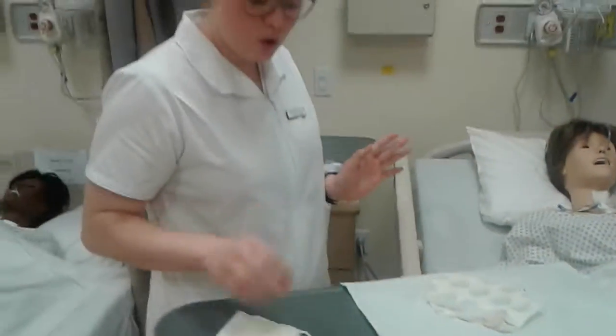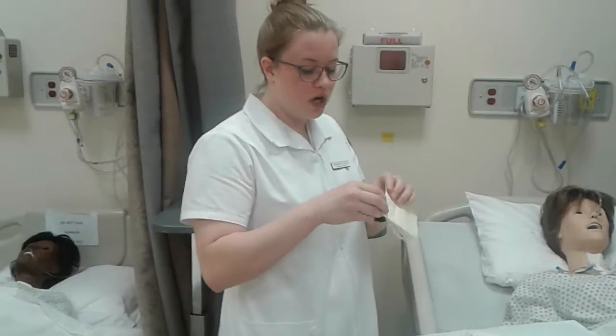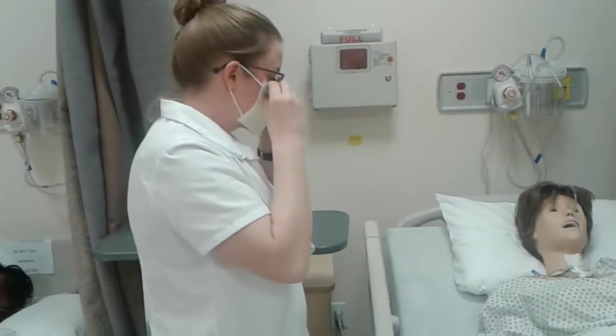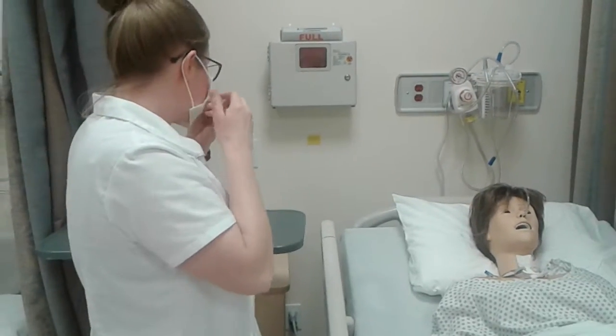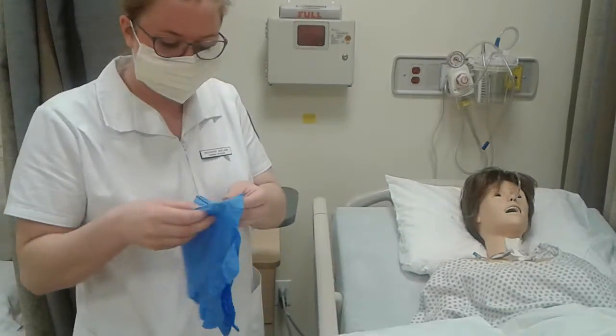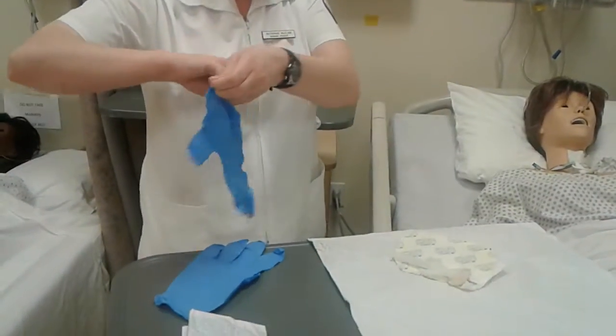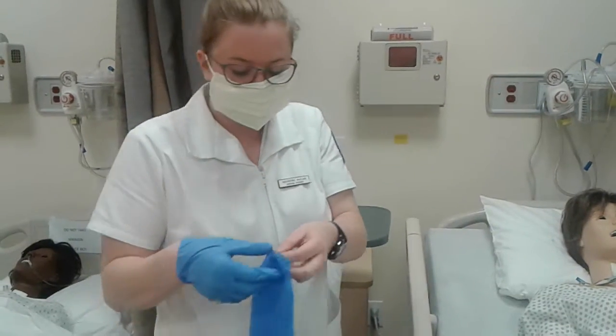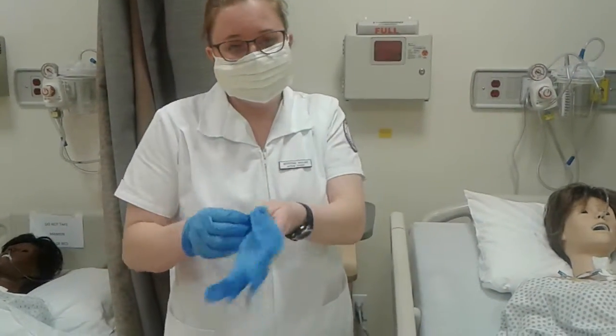So now that I have my kit open, I'm going to don my mask, along with my clean gloves. And I would instruct the patient to turn their head away from the central line dressing. But in this case, I'm going to assist her.